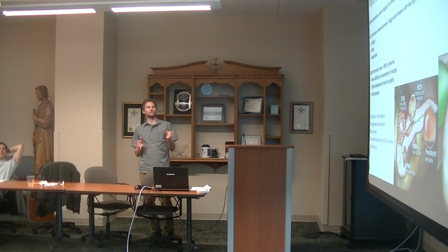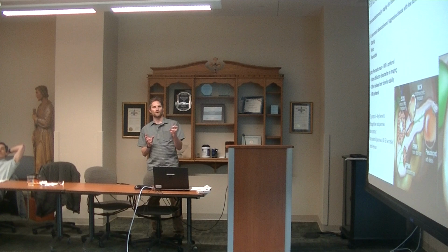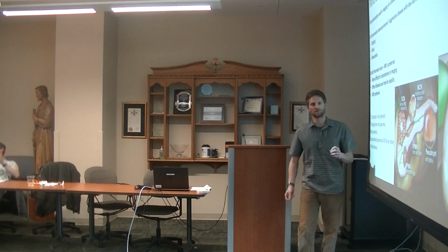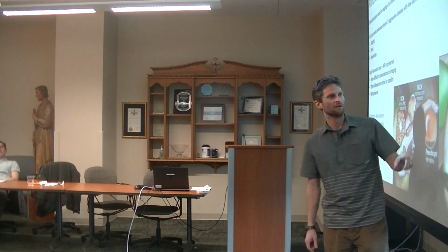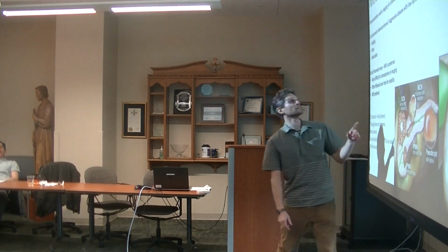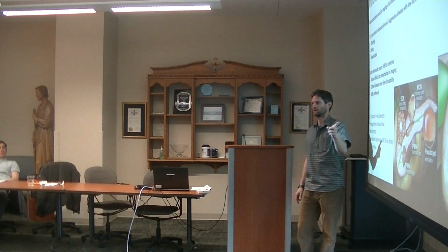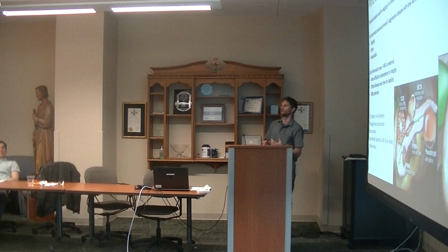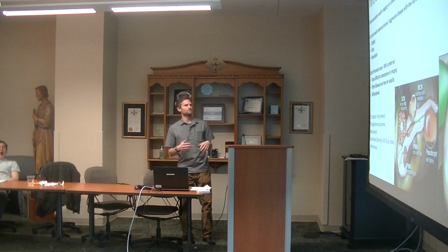So for pancreatic adenocarcinoma, CT is actually preferred. The spatial resolution that we get with CT helps us figure out the tissue planes around all the critical structures around the head of the pancreas. Most of these tumors occur in the head and uncinate process. So we are looking for signs to tell the surgeon whether this is resectable or unresectable. So we need to see if these tumors are encasing the superior mesenteric artery, the superior mesenteric vein, the portal vein, and for that information CT just has better spatial resolution.